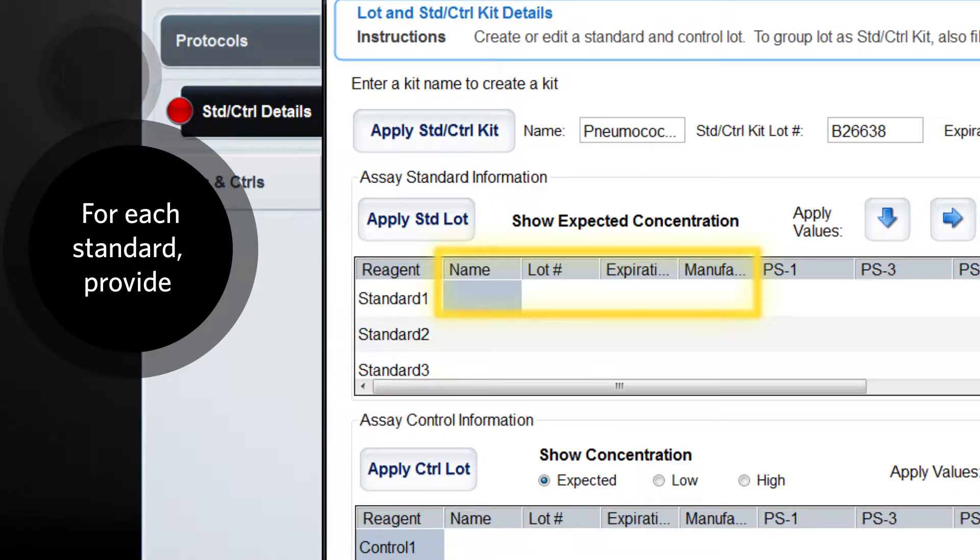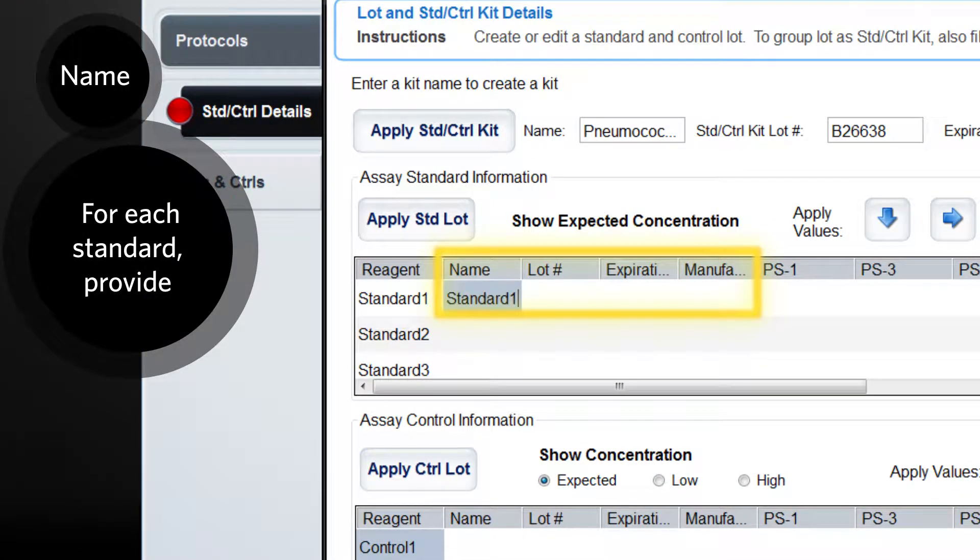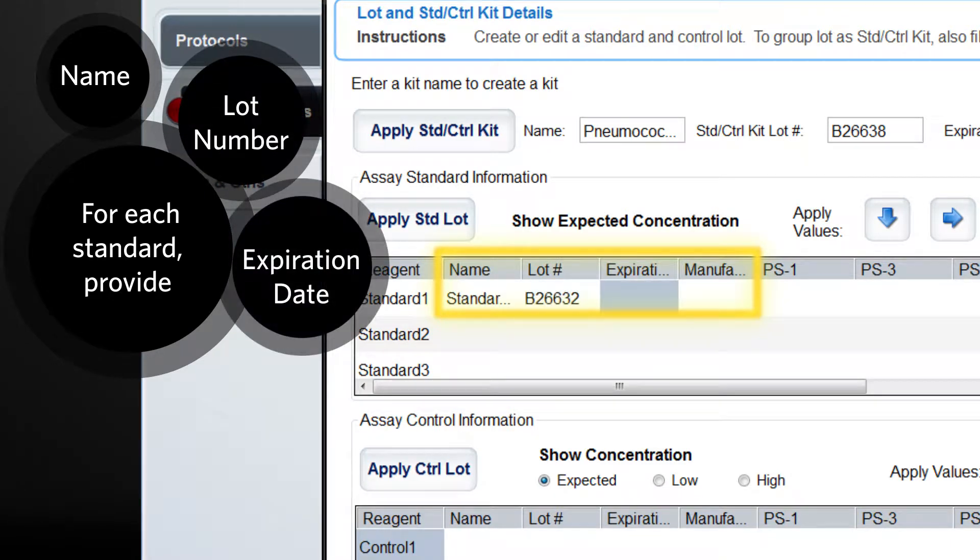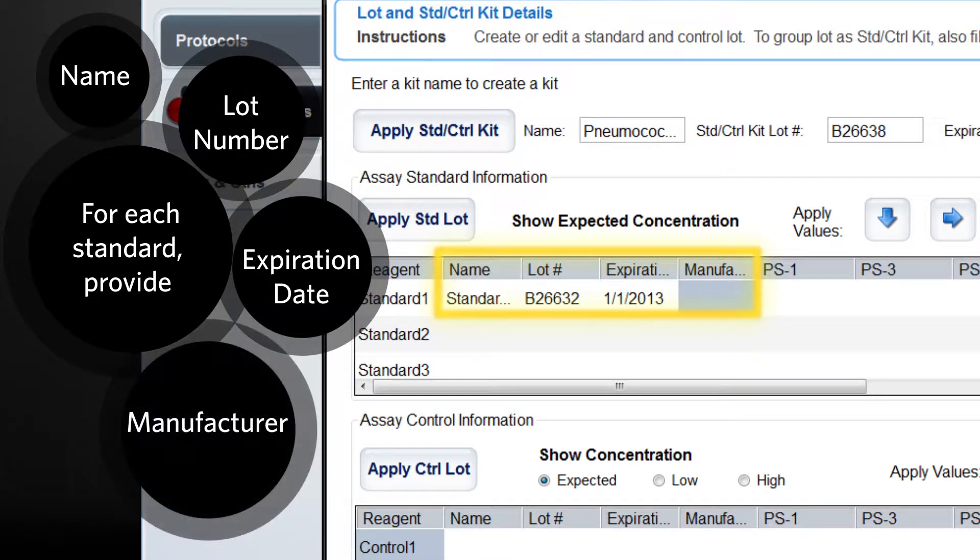For each standard, provide a name, lot number, expiration, and manufacturer.